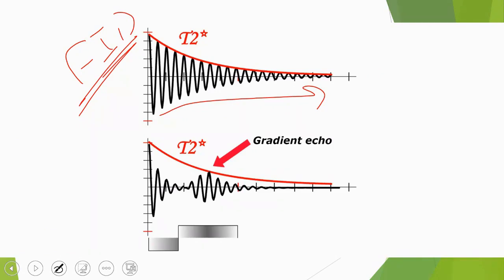The signal amplitude weakens because, over time, dephasing increases, causing the signal to diminish, which means the protons in the X and Y axis move in this manner. As this continues, dephasing increases, and the signal it provides in the transverse plane weakens. The curve appears to drop, continuously decreasing, experiencing damping until it reaches zero.